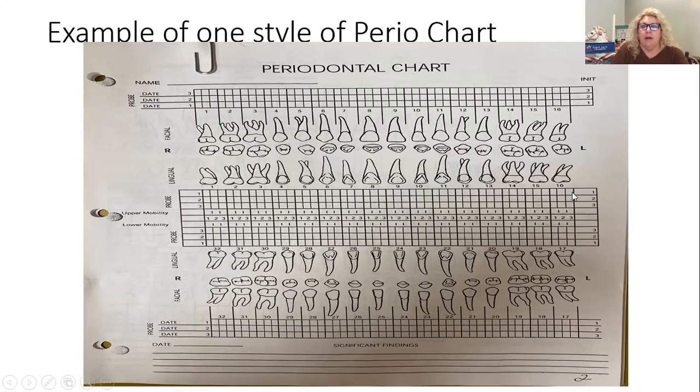So this time we're going to write backwards. Really important. So now we're going to start on the distal lingual of tooth number 16. So the distal lingual of tooth number 16: 4, 3, 3, 2, 2, 2. So we're writing our numbers from right to left this time. So we're going to go all the way through those numbers.